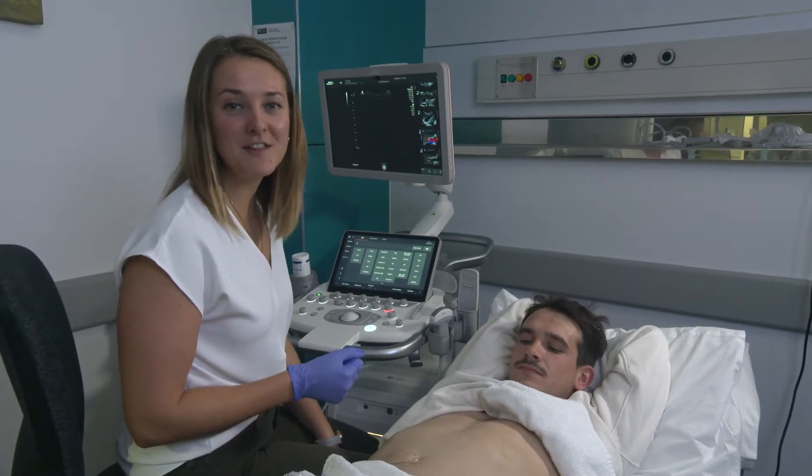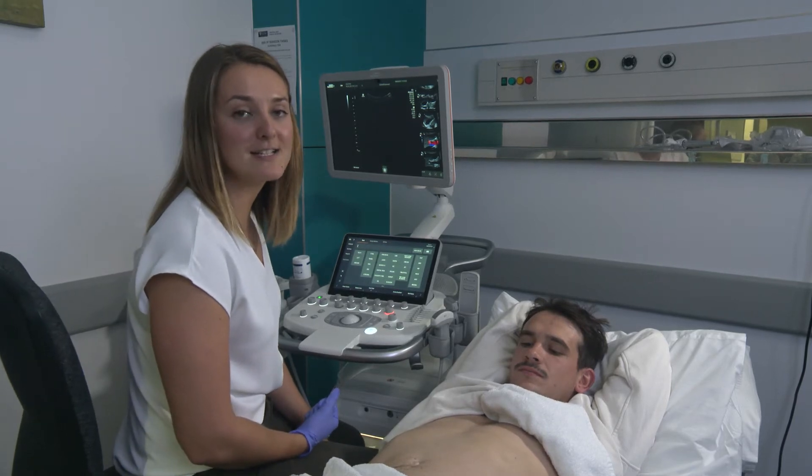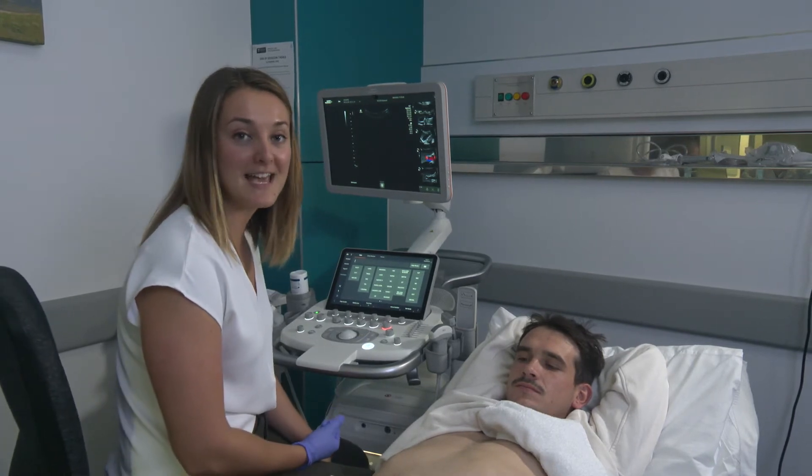Hi, my name is Adriana, and I'm one of the sonographers at the University of Auckland. Today we're going to be learning about how to scan the spleen and the aorta. This is our lovely volunteer, Bruce, who's going to act as a model for us to scan.